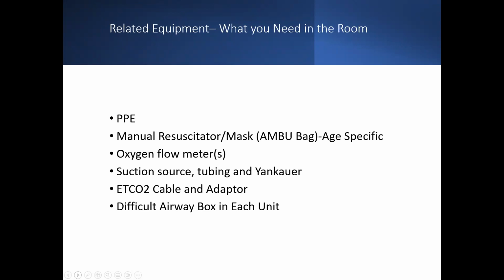I remember I was orienting a new graduate. I was in the surgical ICU where I was once the lead therapist. And I remember I was getting ready to intubate the patient. And I said to him, he was a very nice guy, I'm sure he has grown up to be an outstanding respiratory therapist, so-and-so, can you get me a Yankauer? And really what I meant was, can you get me suction, the Yankauer to tubing? And he handed me a Yankauer. It wasn't connected to anything. It's not funny. Everything went okay in the long run. But I said it to my then manager. I was just recounting, it wasn't bad-mouthing the guy, I said it with a smile on my face. And my manager looked at me and says, well, you asked for a Yankauer. He gave you a Yankauer. So I'm like, yeah.